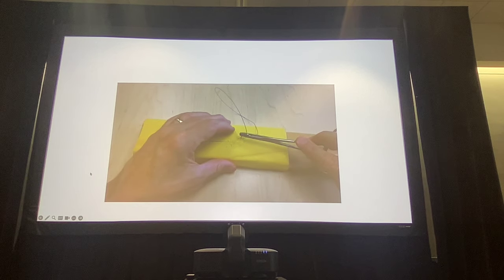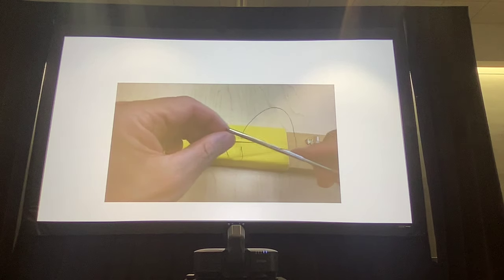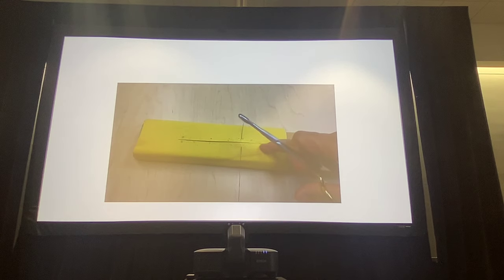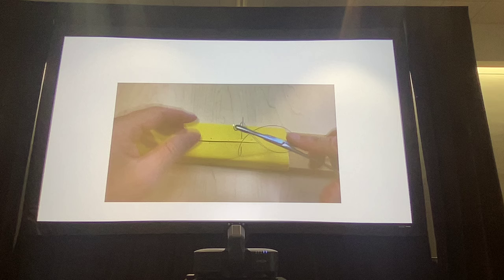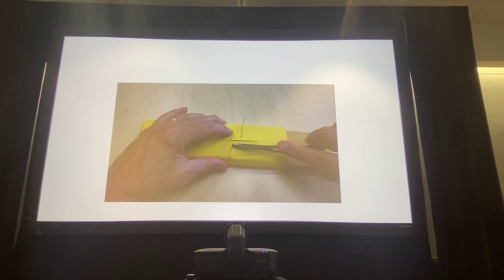Or horizontal mattress, I use a fair amount. I also use it for skin closures that are just failing me. They keep dehiscing. They're in bad areas of the body, like over a joint. There's going to be a lot of motion and a lot of pressure points there from the pet just existing at home. So I like this pattern to help maintain the strength of the closure.